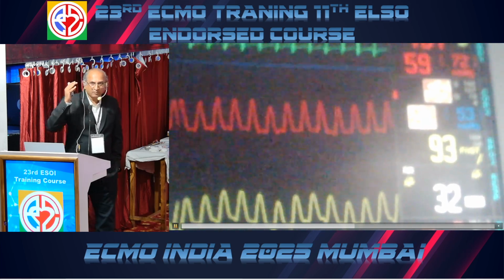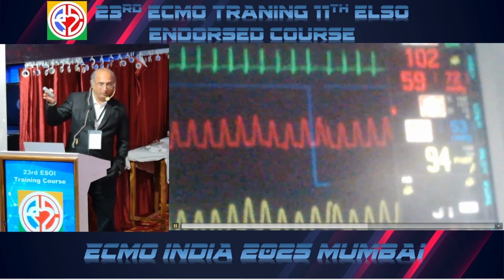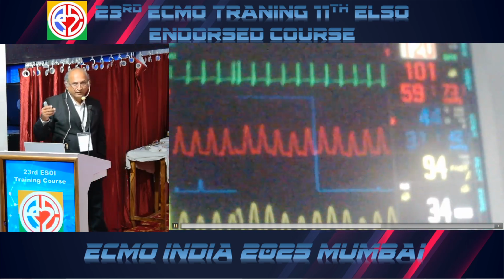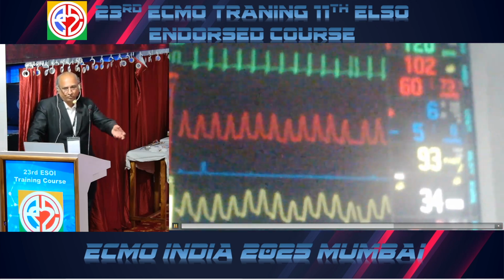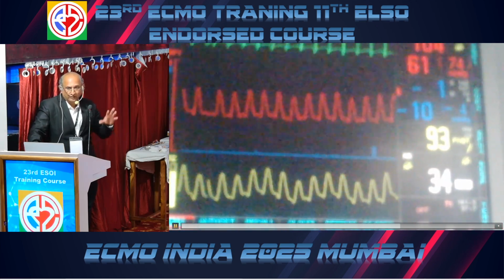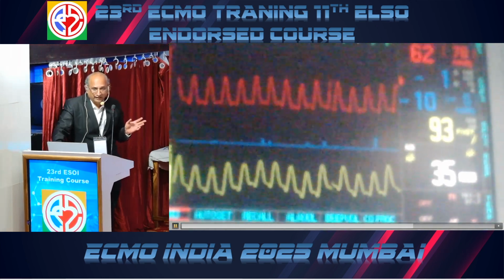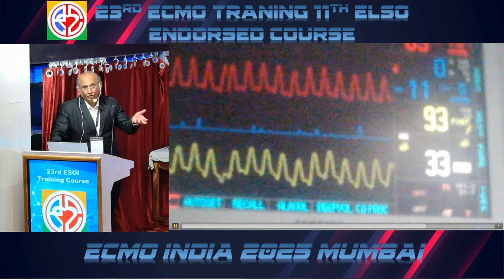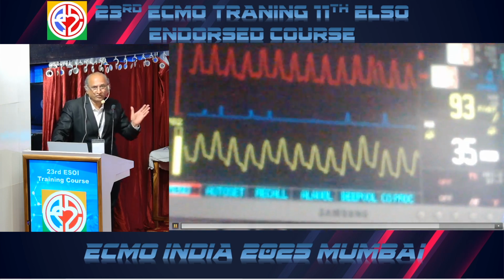We thought that we might be able to come off ECMO completely and may not have to change the oxygenator, because that is going to add to the cost. So we were trying to avoid changing the oxygenator. That was the initial thinking, that we would come off ECMO in 1 or 2 days, and there was no other sign except an increase in the delta pressure. He was maintaining good oxygenation because his lung was also contributing. At the same time, there were no signs of hemolysis. So we said we'll just avoid it.